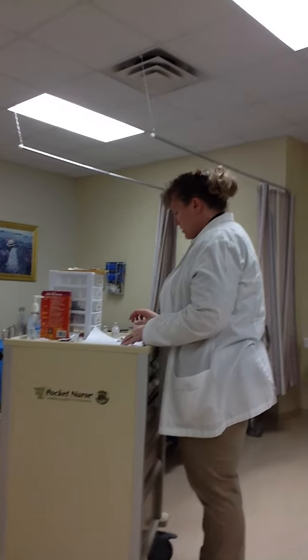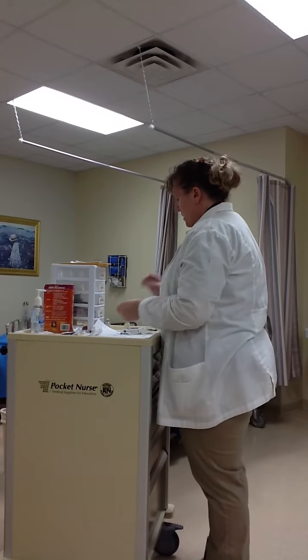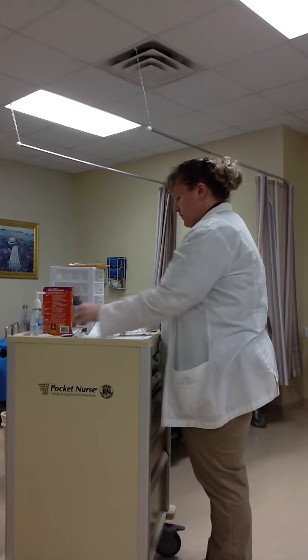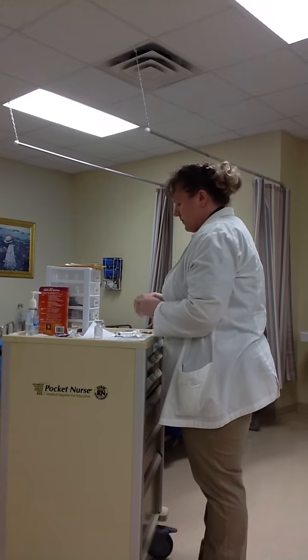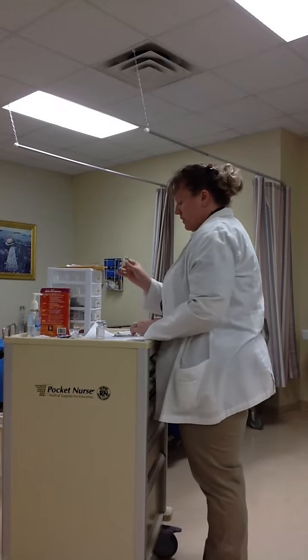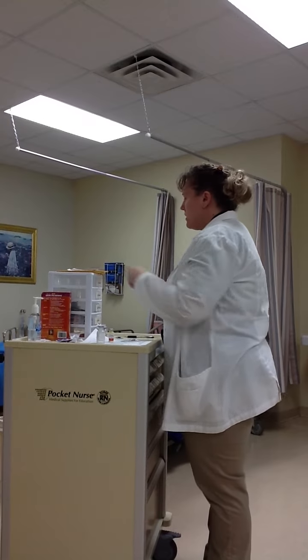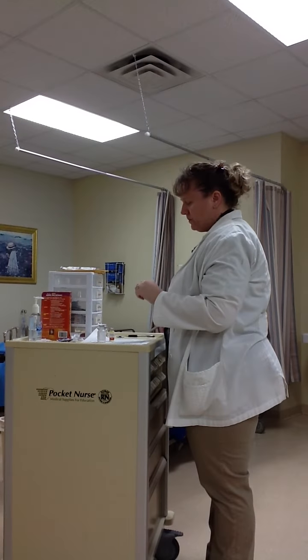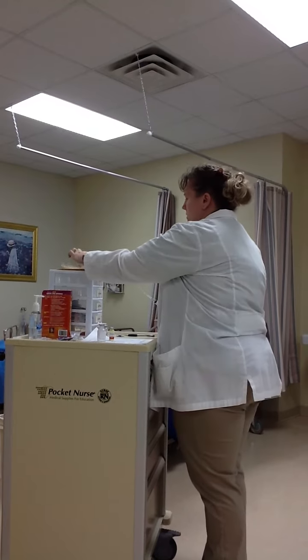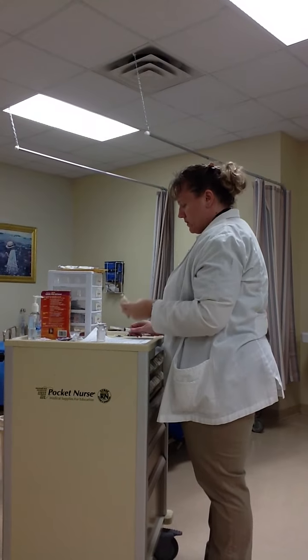So I'm going to clean the top of my normal saline and just let that set to the side. I'm going to pop the top on my Phenergan. I'm going to open up my syringe, open up my needle, screw those together. According to this, I want 5.6 mLs.